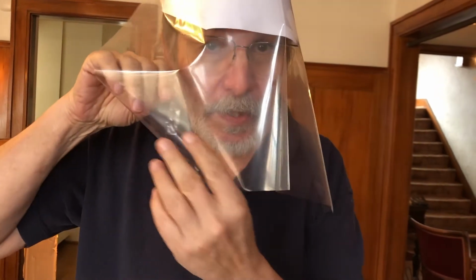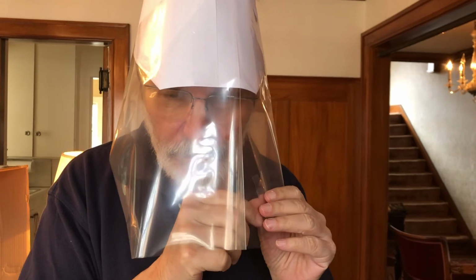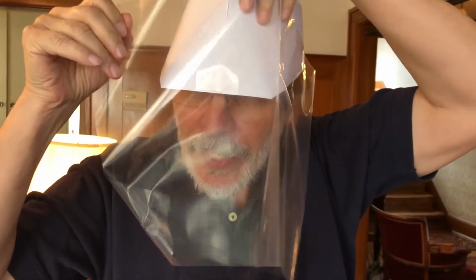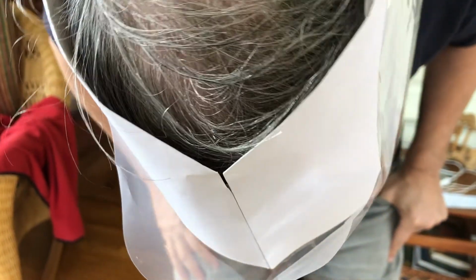And then you can roll it up to whatever angle feels good. Touch it to itself. You get this nice stormtrooper effect. And there we are. Obviously there's a lot you can do here and here, but there it is. Now in this case there's not, I don't think, a lot of venting through here, but it's adjustable. So I'm going to loosen this one a little bit so that I have a little bit of air. I'm going to tape it down again like this. And now, as you can see, I hope there's a little bit of venting. And there you go. The end.